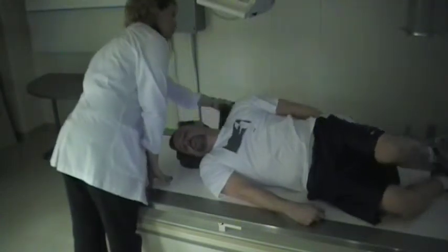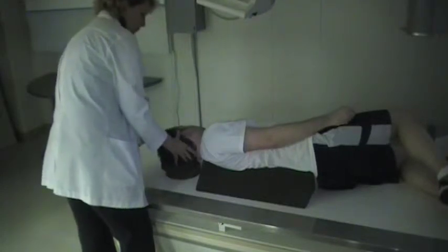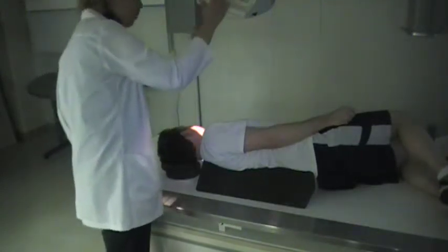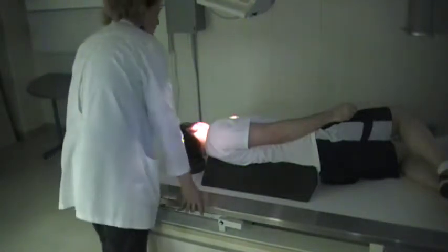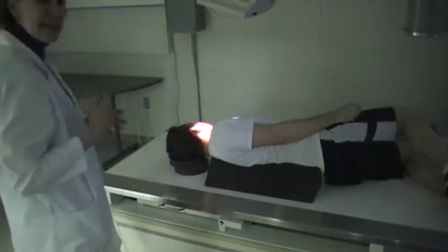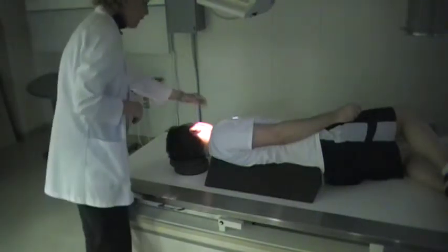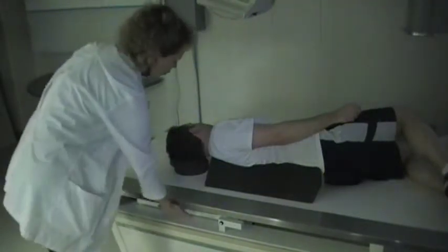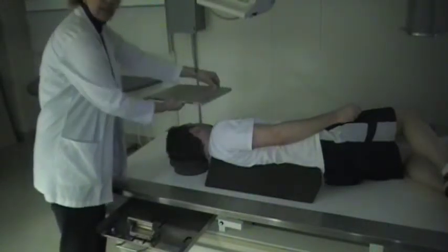For the left oblique, have the patient turn to the left about 45 degrees. Relax that shoulder. It's the same angle as before — 15 to 20 degrees — and you just want to get centered over the mid-neck and check the thyroid cartilage, having your line cut across that. Again, you're at C4 at this level. Since we are doing the left oblique, place your left marker either on the left side of the neck or on the left side of the cassette.